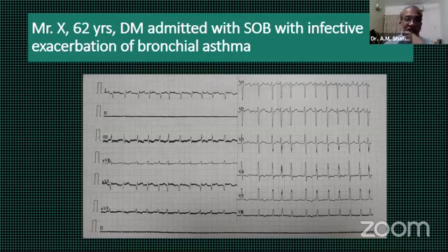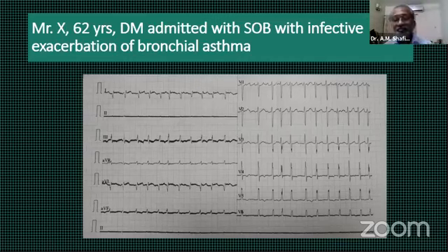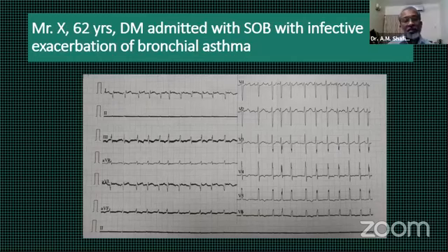AVR, T inversion. Sir, AVR. T inversion, sir. And there is positive R wave in AVR, sir, also. Is there anything else? Positive R wave in AVR. There may be, sir, misplacement of the lead, may be a possibility, sir. What is the lead?